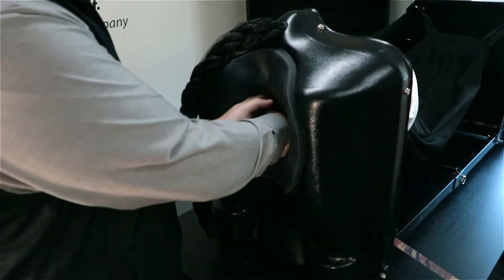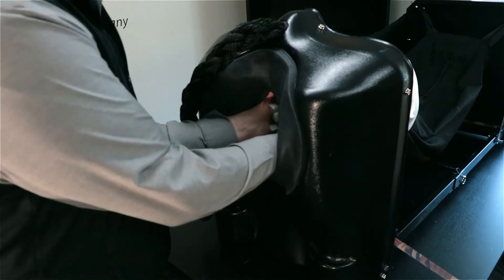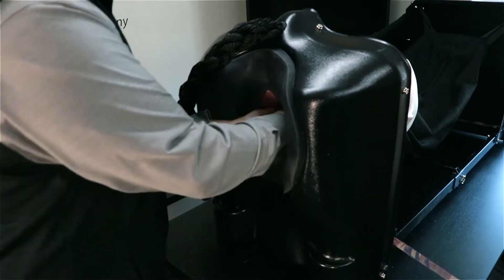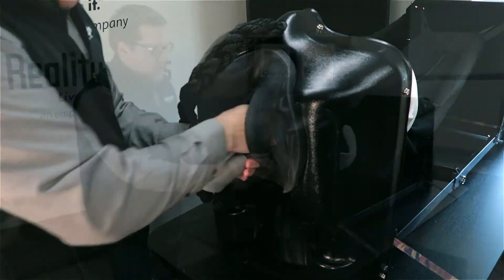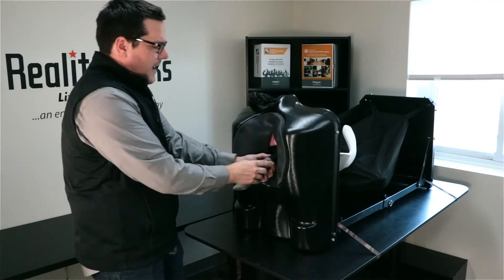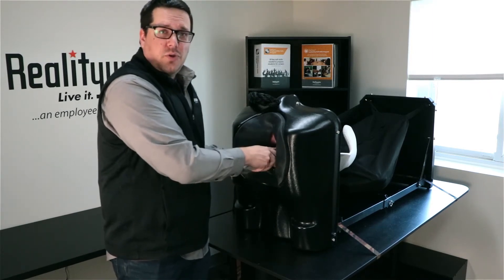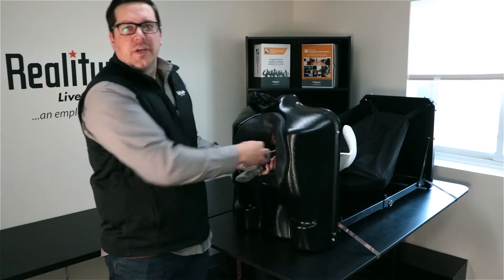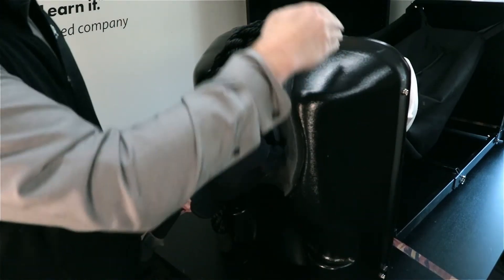We're now going to go inside and pull. Looking inside, I can find the hooves and I found the head, so I know it's in the right position. I'm going to pull up with the hooves — there are different spots so you can know the landmarks and know where to put the strap if you're going to use one. It's not an easy pull, just like it wouldn't be in the real thing.